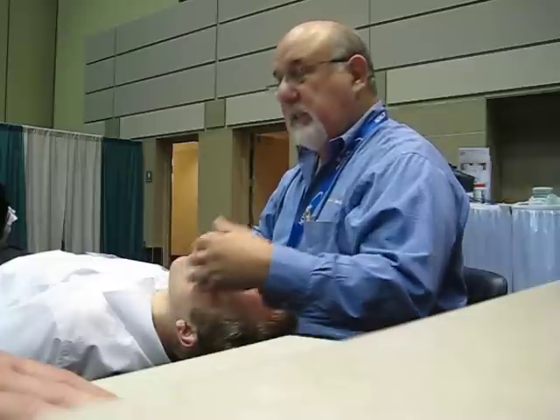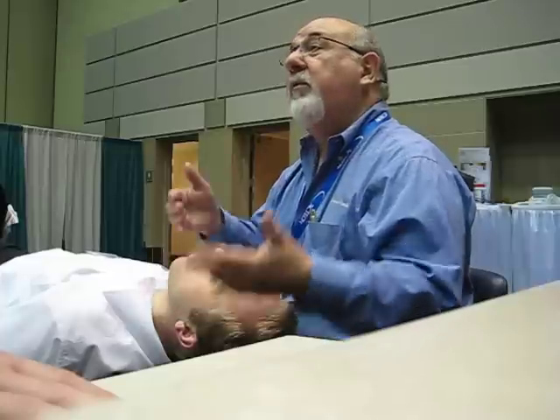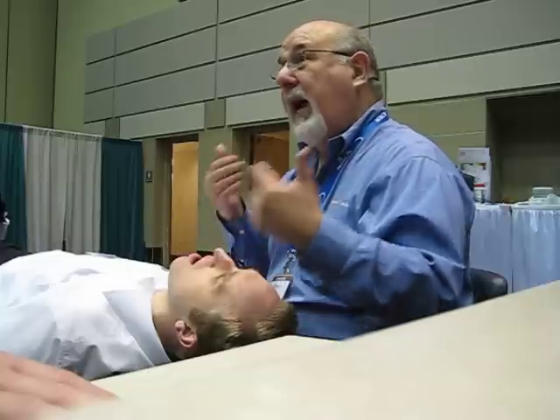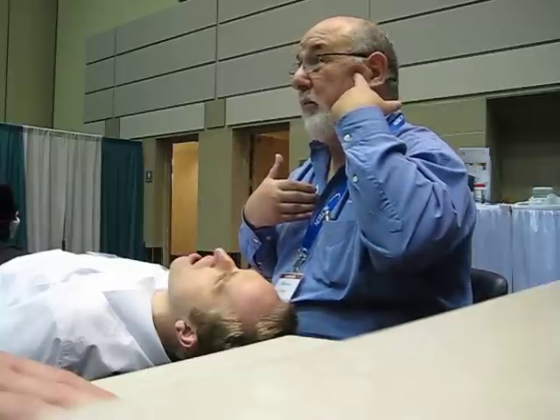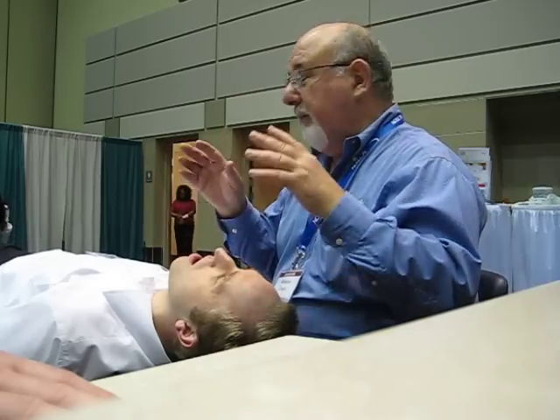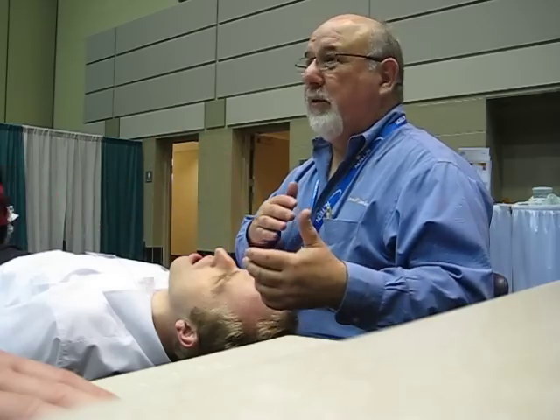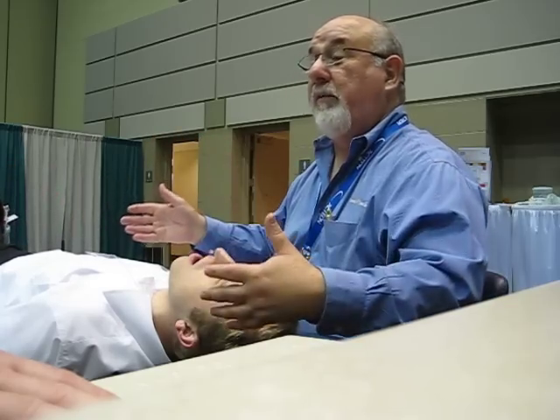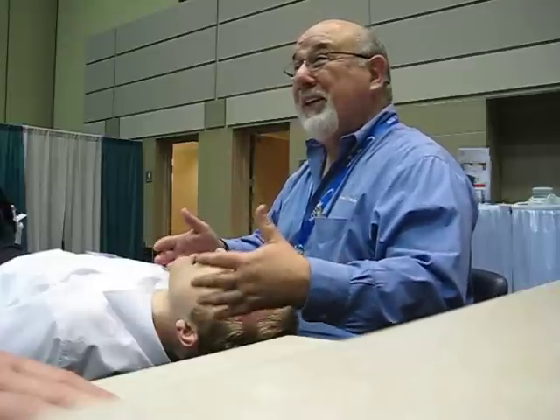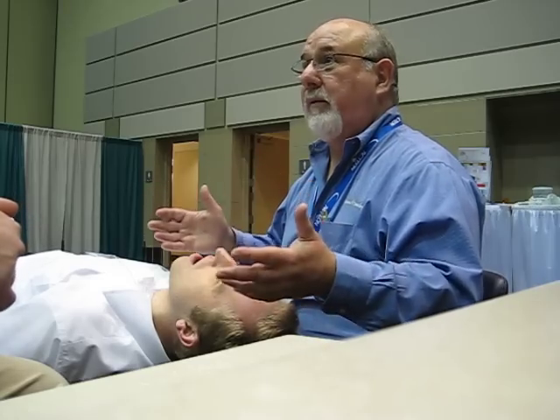When I work with a doctor and we go through this, I say, have you ever been able to see that much of the area? They say no, they've not. I actually had a CEREC put in way in the back on the upper, and I had to stop my doctor and say, stop, you're killing me. She was retracting so hard. I said, drop me back further, get my occlusal. I positioned myself in the chair, and I said, now go in there. He goes, wow, this is amazing. He said, I'm always afraid to do this because patients complain. I said, the key is you've got to do it really slow.